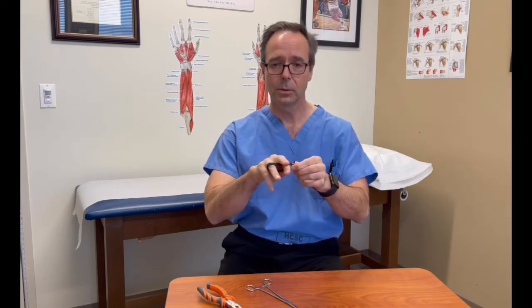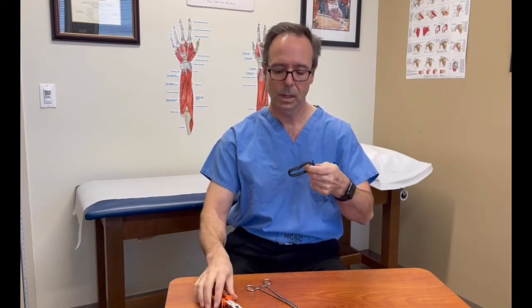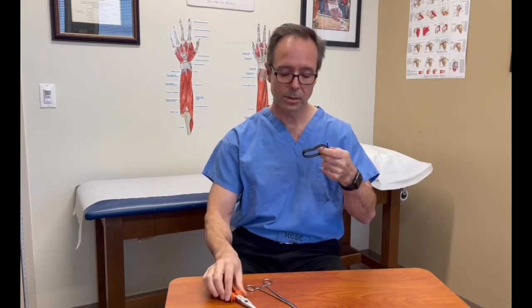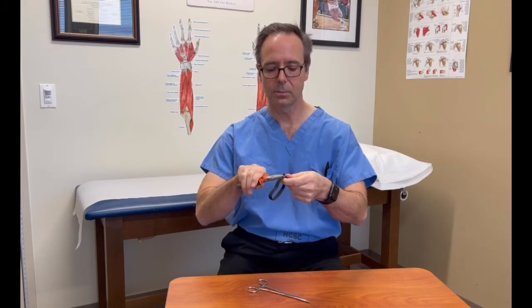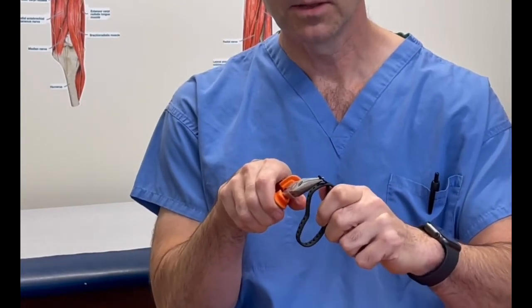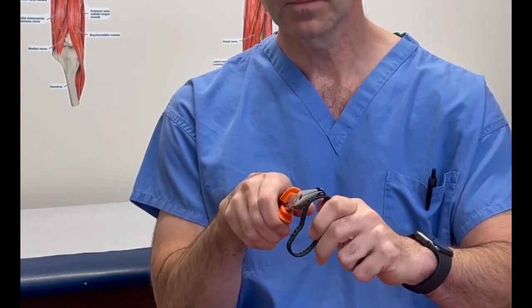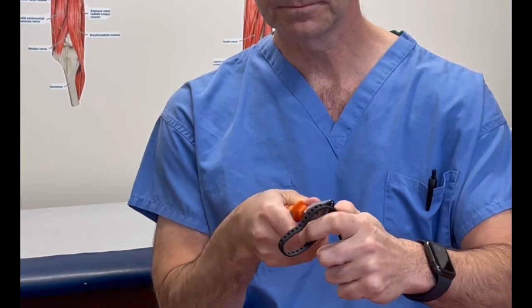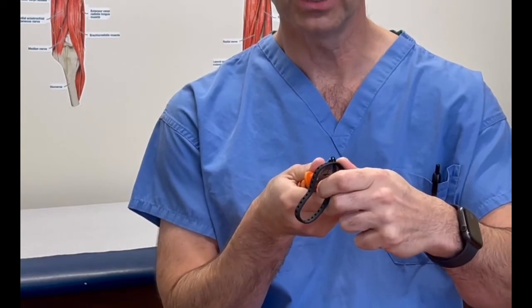So then we take it back off of the hand and we're going to lock this first tab. We use either a needle nose pliers or a smooth needle driver. This one's a little larger, sort of a medium or small size needle driver. I'll use the needle nose pliers in this case. And if we could zoom in here, I'll try to keep my fingers out of the way. We grab the tab and we leave 2 or 3 millimeters off of the edge of the tab. We then rotate our forearm into supination, dropping the end of that tab into the adjacent perforation.